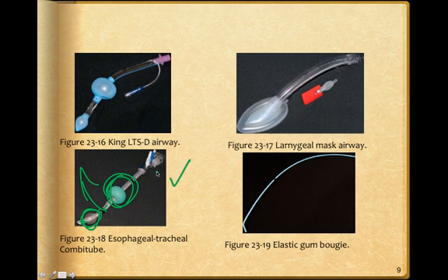It's always a good idea to confirm it with some kind of CO2 confirmation like capnography or colorimetric to be sure that we're in the right location or we're ventilating appropriately. Sometimes ventilating the stomach can move the chest as well.